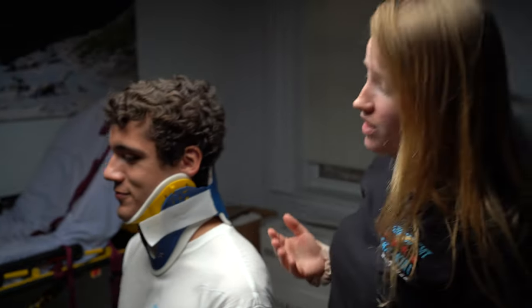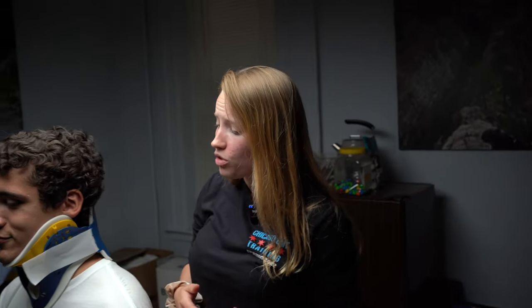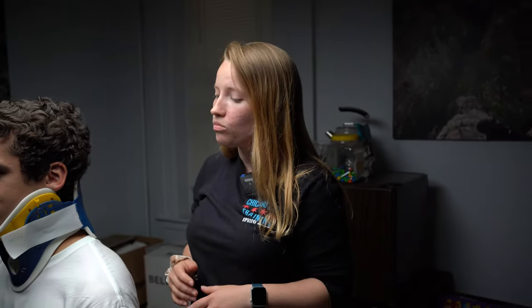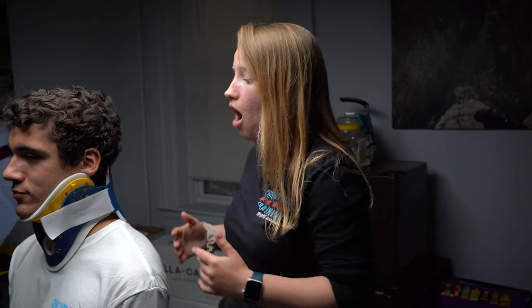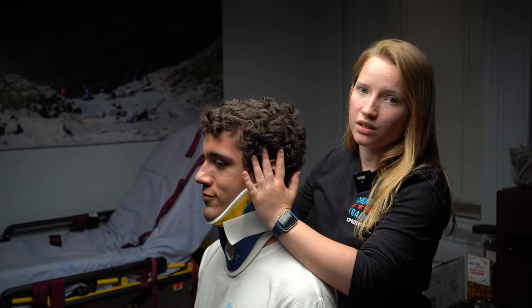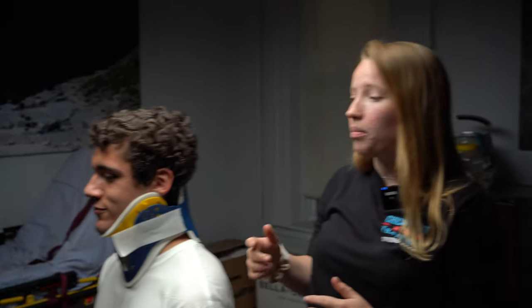Your patient can still move their head — if this is a fully responsive patient, even alert and oriented times four, instead of holding c-spine the entire time we can have them sit on our stretcher and just not move their head. However, if this is a severe trauma and the patient is unresponsive, intoxicated, or has distracting injuries, and we decide to backboard the patient, then my partner is going to hold c-spine even with the collar on. Remember we're holding c-spine before we put the collar on, and we're not putting the collar on until we assess the neck first. We hold c-spine all the way until we have the backboard and the patient's head is secured with the head straps.